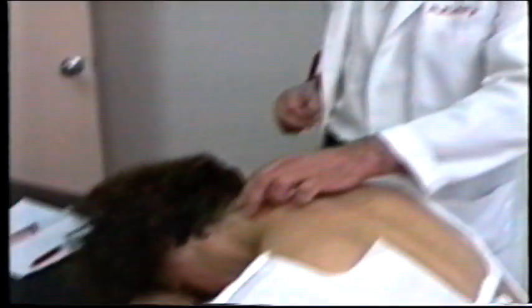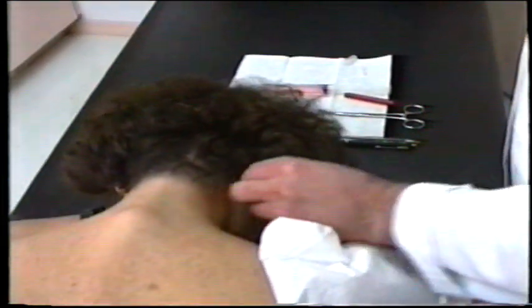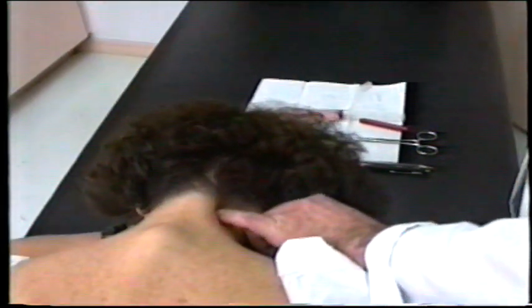So at this point I'm going to be addressing the facet joint at C4-5 level on the right side. This syringe is filled with 1% xylocaine. As you can see, the area was marked previously, and at this time I'm just prepping the skin with the alcohol. The approach I'm utilizing is the one described by Badiuk, which is a posterior lateral approach. I'm rechecking the area of tenderness at this time.